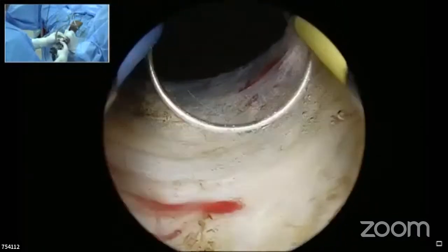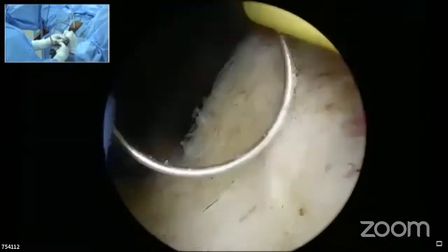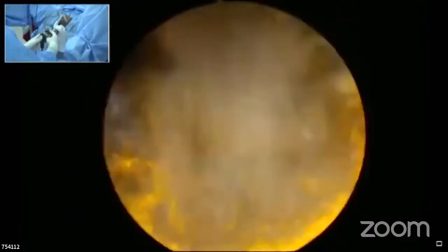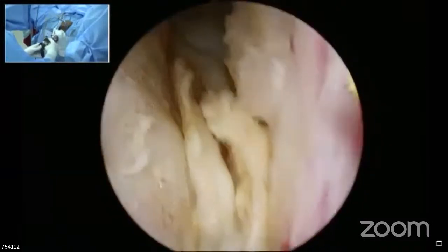So it is acceptable if we slightly under resect at the bladder neck at 5 and 7 for the median lobe, and we can come back as the last step of the procedure to resect out whatever is left behind. So I'm deepening the groove at 7 o'clock now.